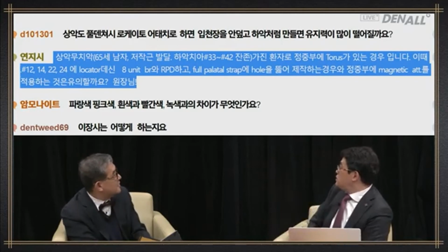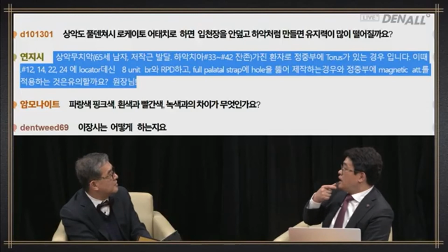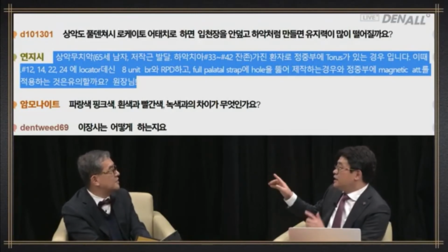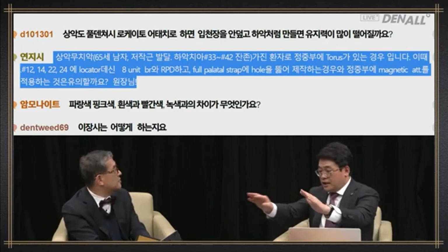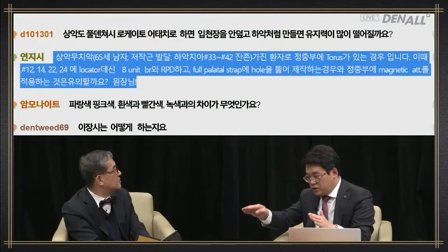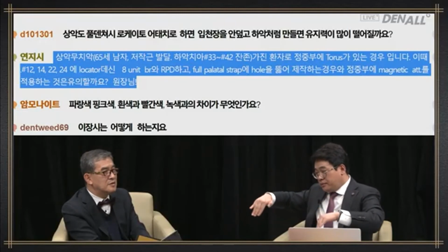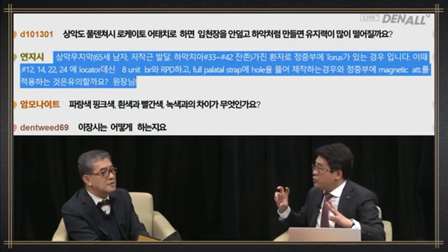What is magnetic attachment in the center? I think this holds no meaning. This is about making 8-unit bridge and surveyed crown and RPD, and this is a very nice question. I don't want you to think about magnetic attachment. It is position 2-4-2-4. If the arch is V-shape, when we make 8-unit bridge, posterior span becomes short, and therefore, it is okay to use AP palatal strap.